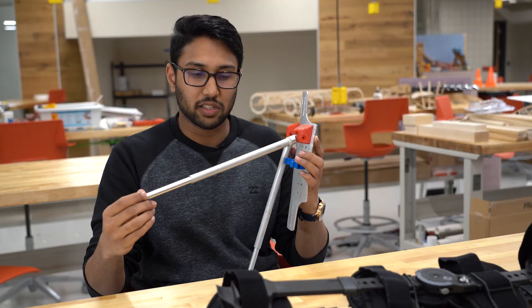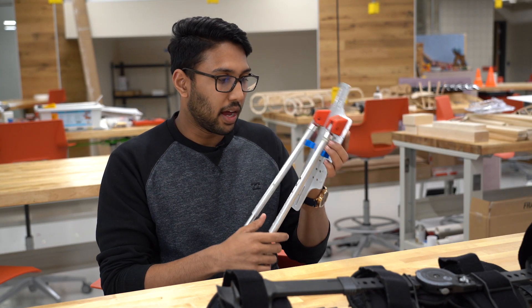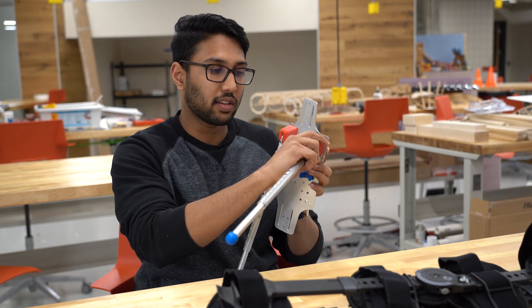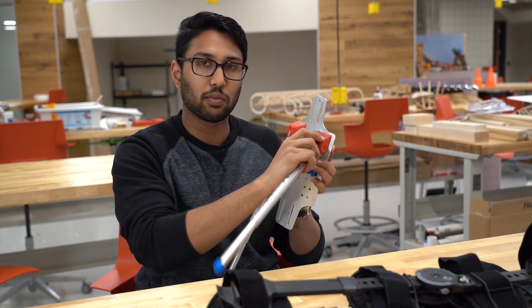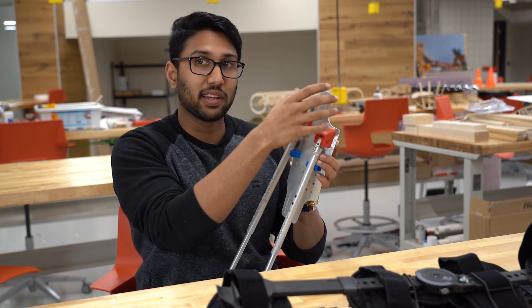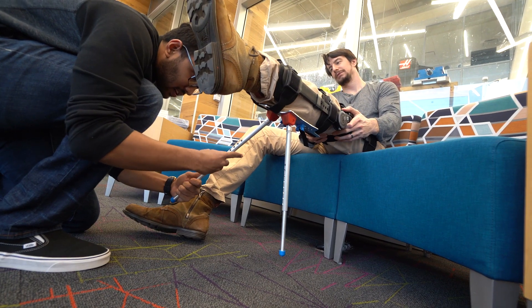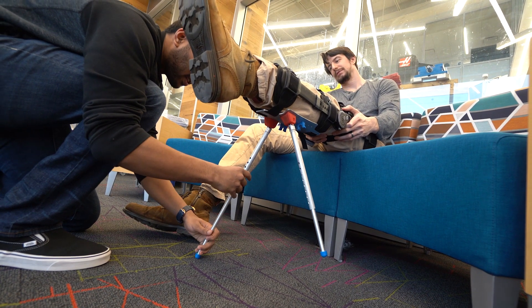We made each leg adjustable with a snap-fit mechanism, and additionally the base of the leg where it rotates from is also adjustable along the plate. On top of that, the plate itself is adjustable along the leg. So there are many degrees of freedom that you can adjust — it's really up to the user's comfort.